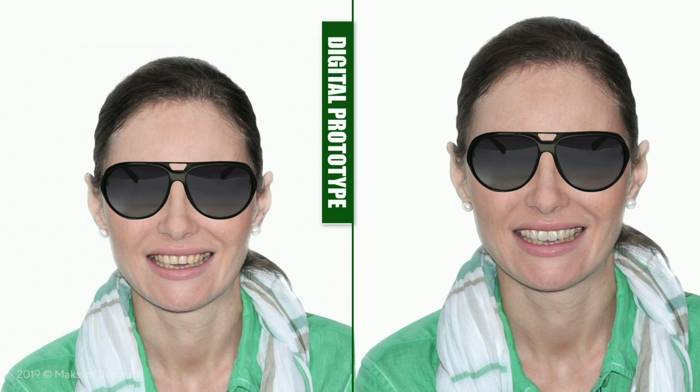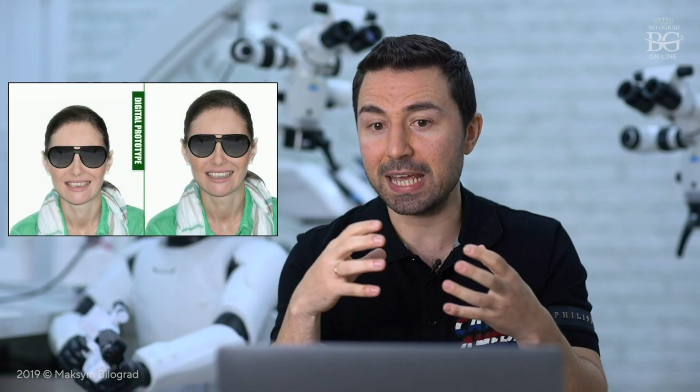Before I go into the next slides, I would like to point out that this digital proposal is like a sketch, an initial thing, not even a base, just an initial idea regarding the aesthetic outcome.